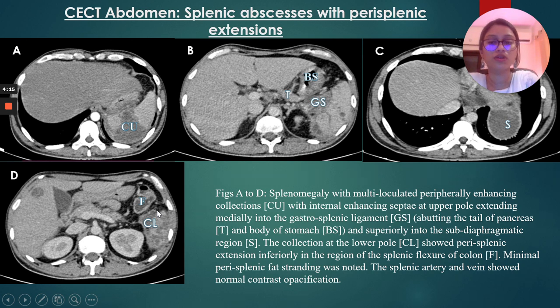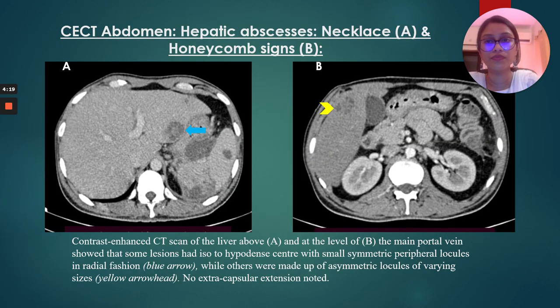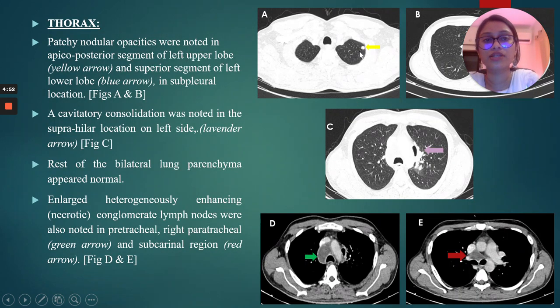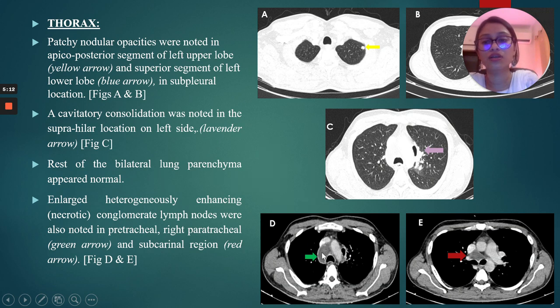There was minimal perisplenic fat stranding noted. The splenic artery and vein showed normal contrast opacification, ruling out thrombosis. CT of the liver at the level of the main portal vein showed lesions with an iso- to hypodense center with small symmetric peripheral locules arranged in a radial fashion, resembling a necklace pattern of hepatic abscess. Another lesion showed asymmetric locules of varying sizes with no extracapsular extension, representing a honeycomb pattern of liver abscess. In the thorax, patchy nodular airspace opacities were seen in the apico-posterior segment of the left upper lobe and the superior segment of the left lower lobe in subpleural location. A cavitatory consolidation was noted in a suprahilar location on the left side. Enlarged, heterogeneously enhancing necrotic lymph nodes were noted in the mediastinum.